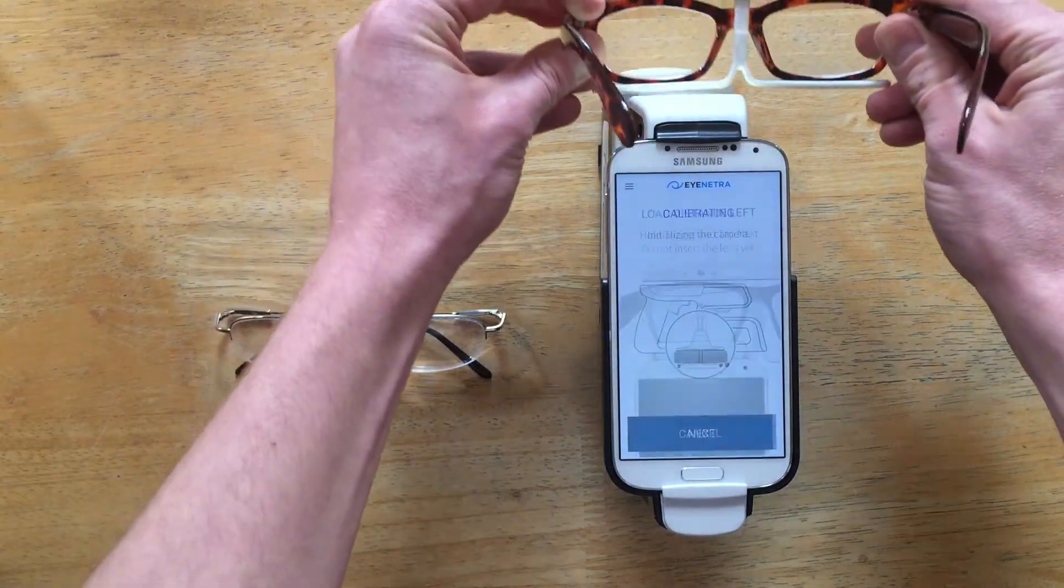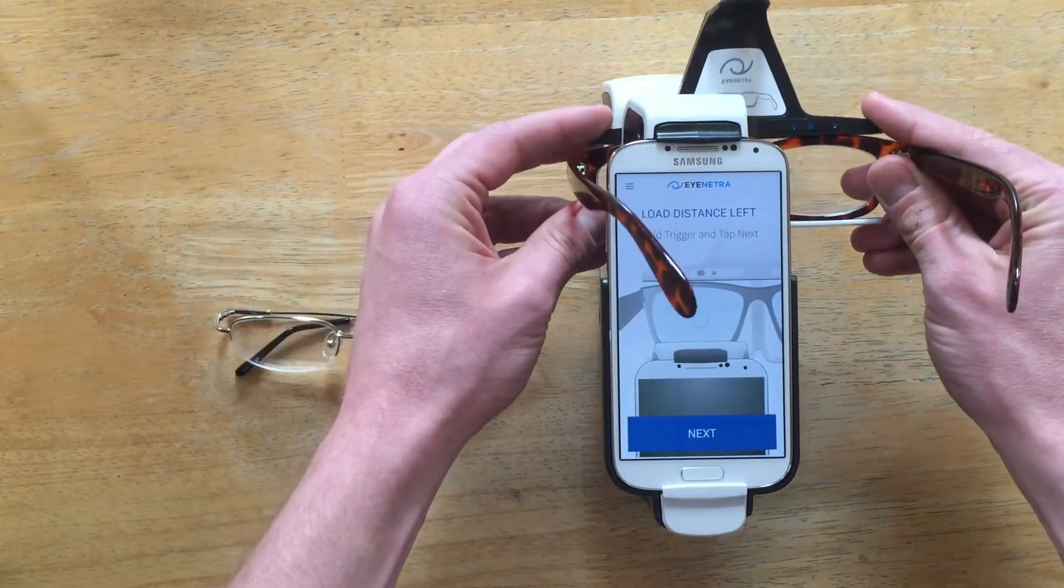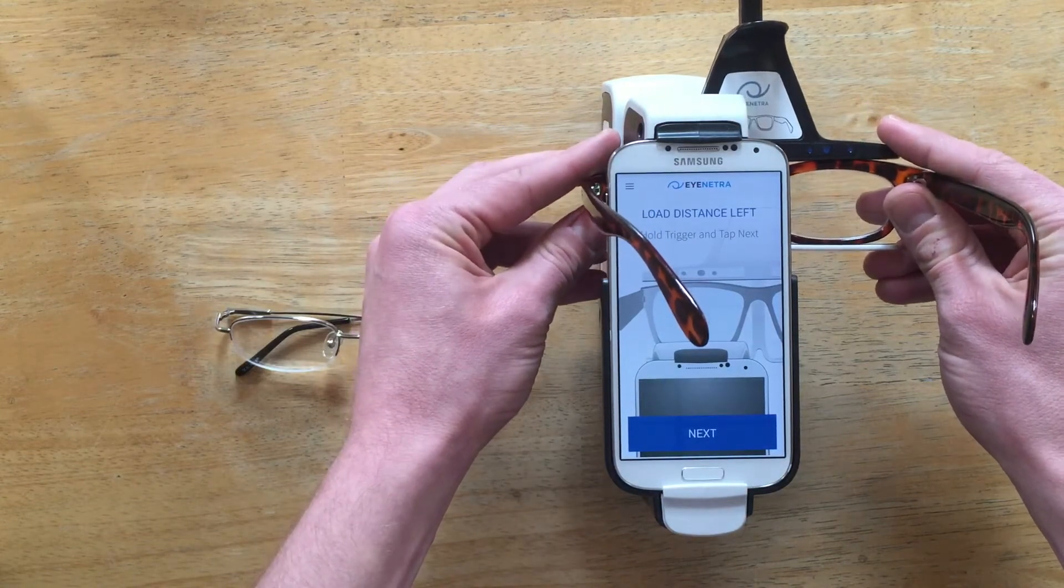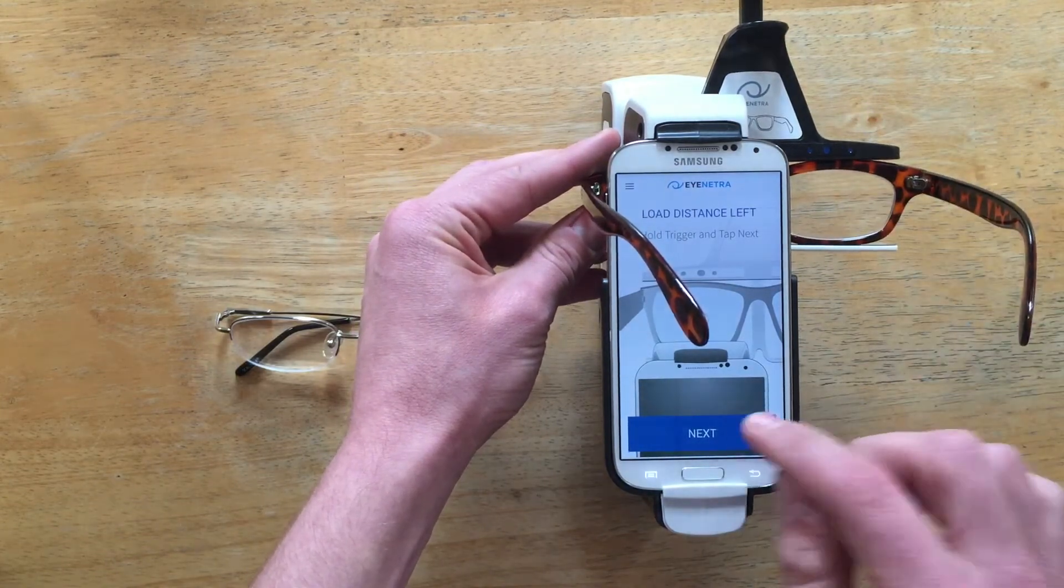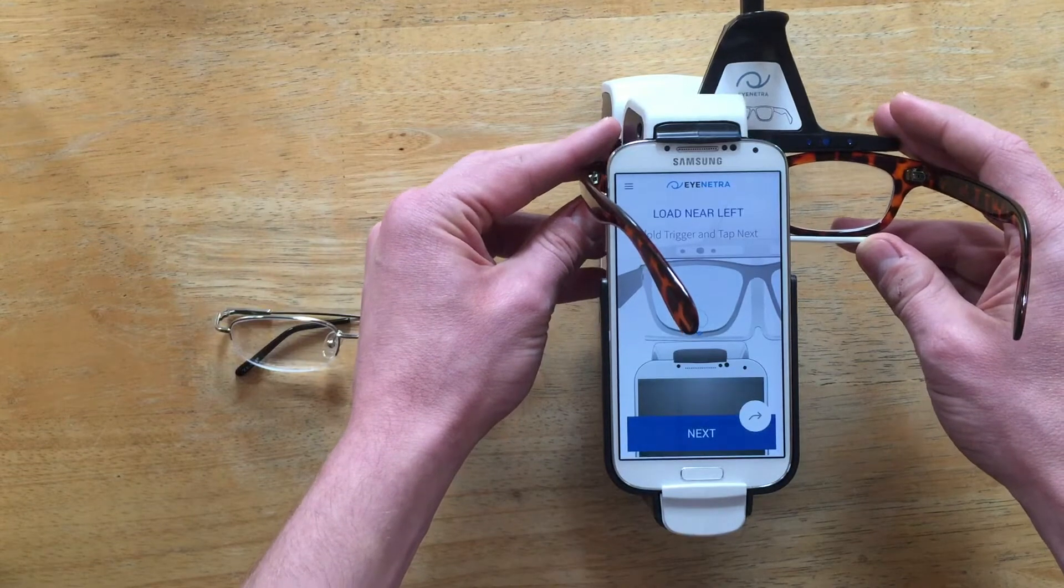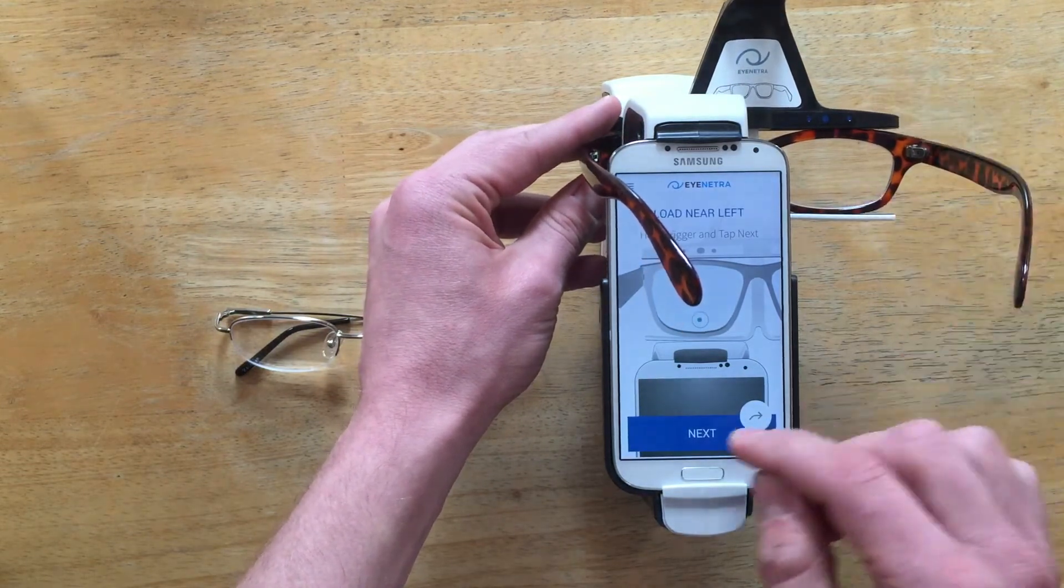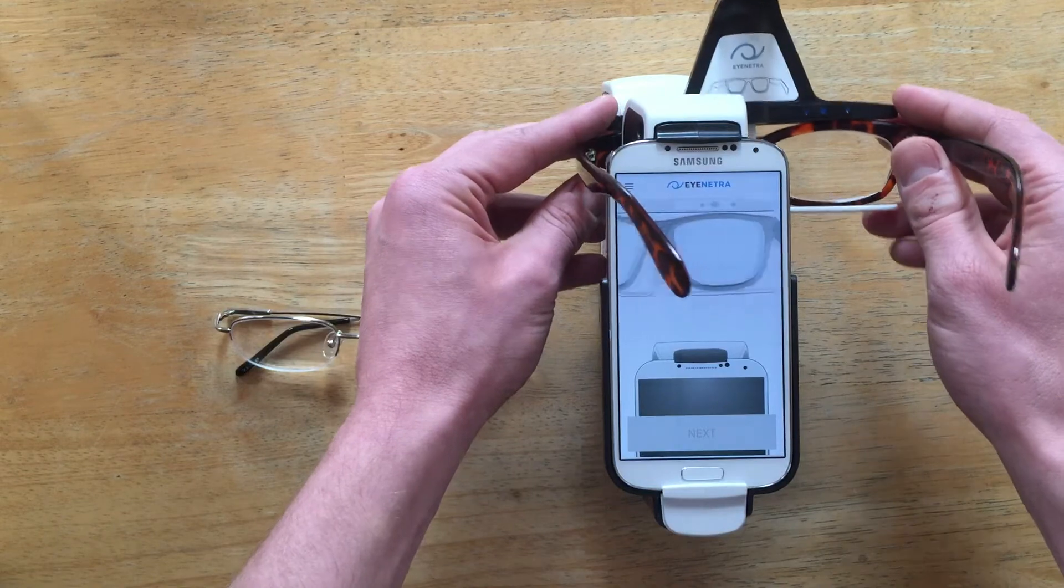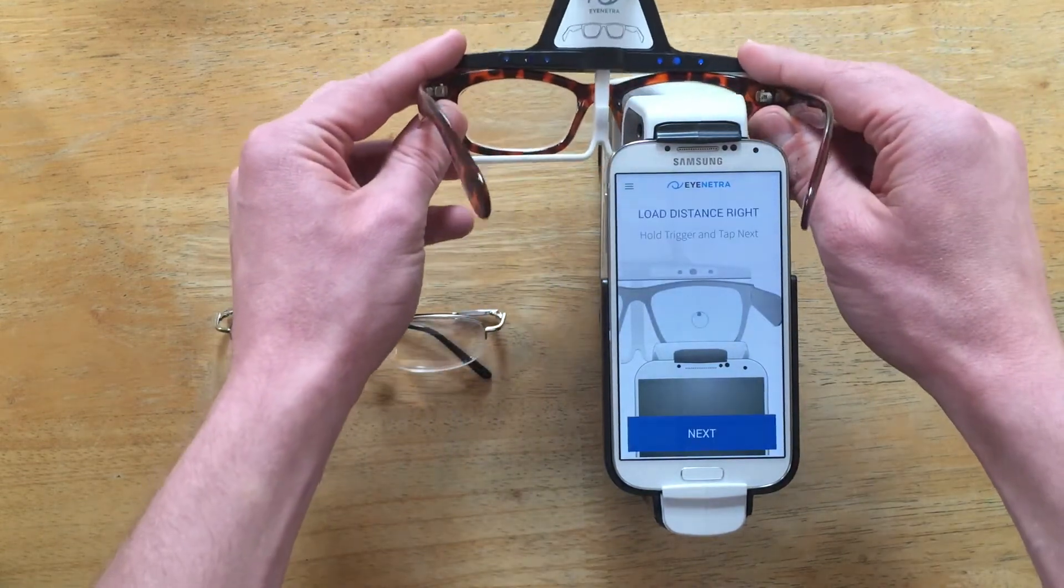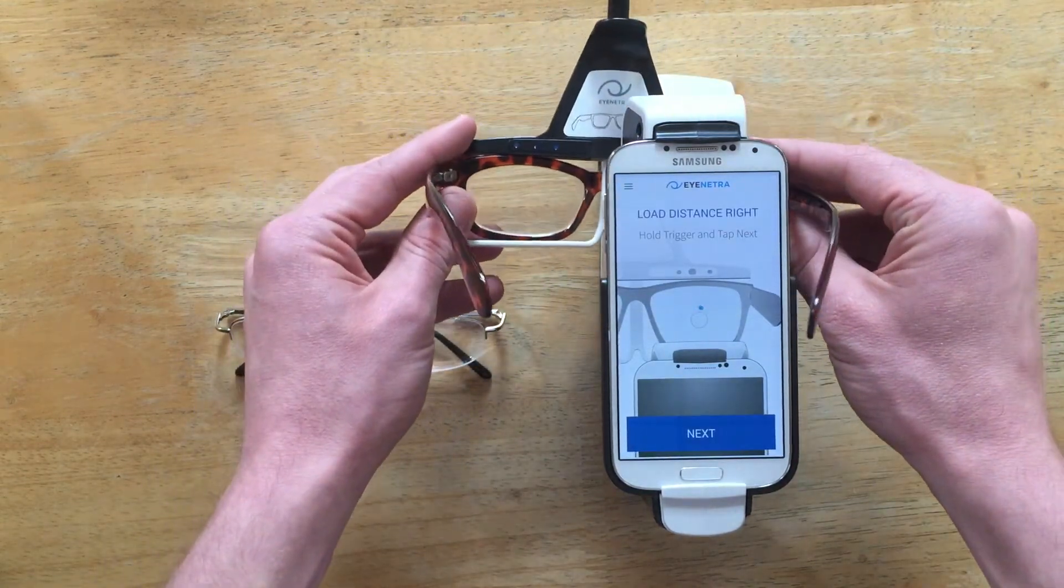Insert the glasses. I'll take the distance measurement, slide them slightly forward to grab the add, and then repeat. And you'll notice again when I use the Smart Stage I am omitting the use of the trigger.